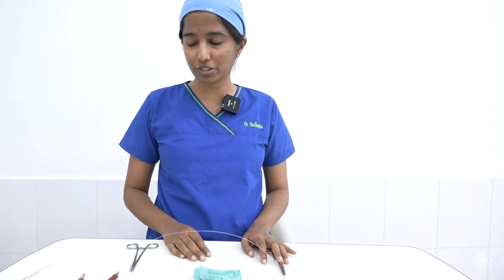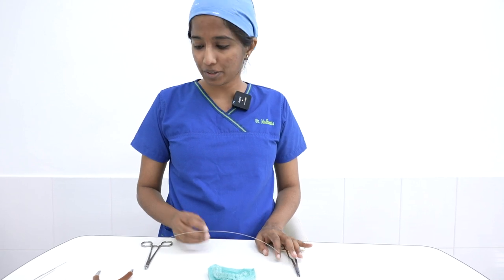Hello everyone, I am Dr. Madhumita and I am going to demonstrate today a technique of intermaxillary fixation called the IV eyelet fixation.